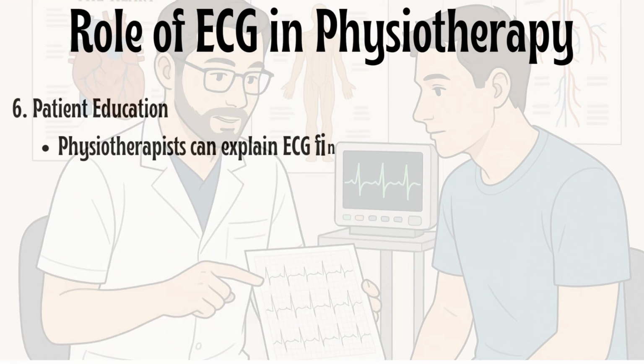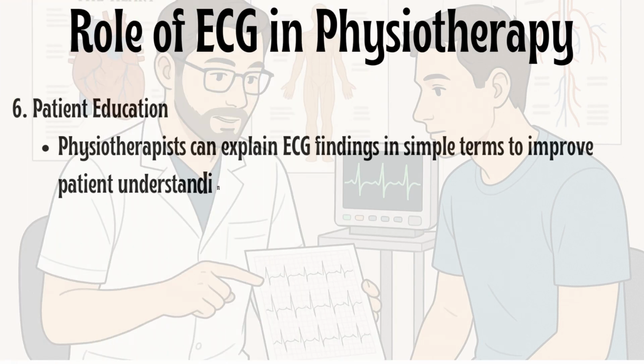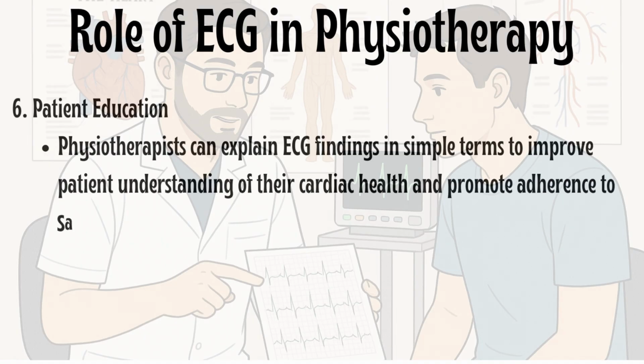Physiotherapists can explain ECG findings in simple terms to improve patient understanding of their cardiac health and promote adherence to safe exercise guidelines.